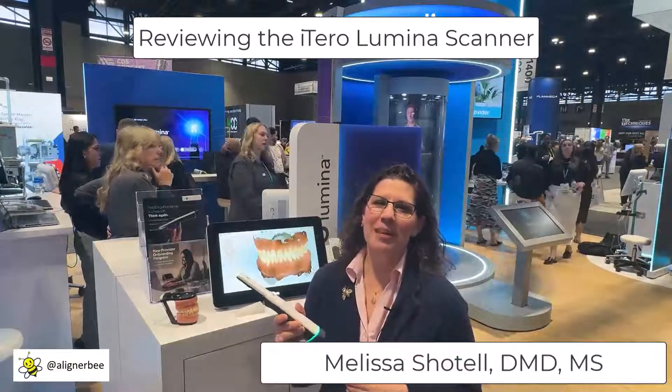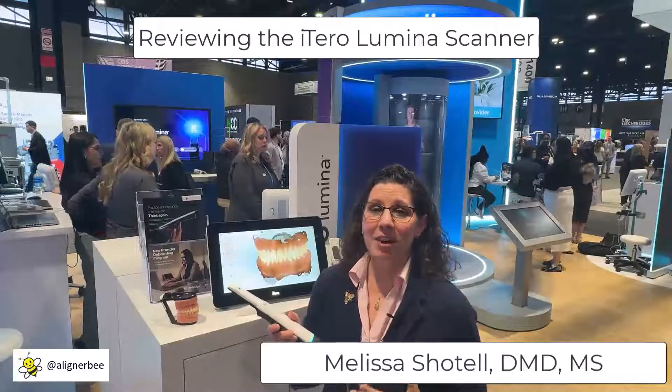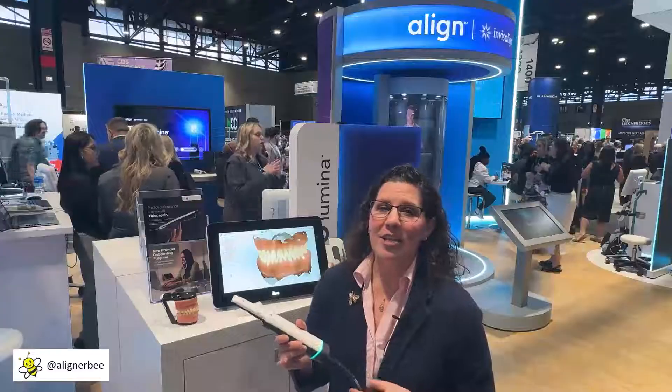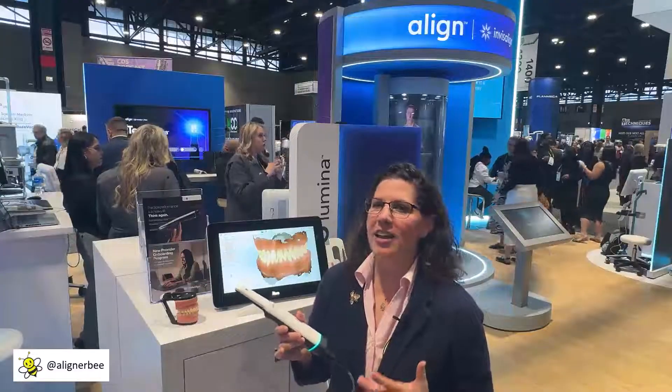Hi, this is Dr. Melissa Chotel, today at the Chicago Midwinter Meeting, and there has been a lot of talk in the dental tech space about the new iTero Lumina scanner, so I had to come over and really check it out for myself.